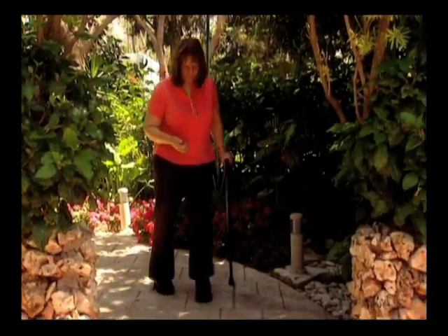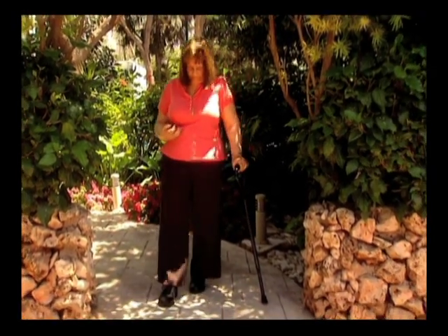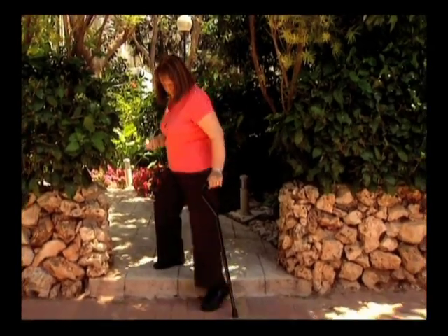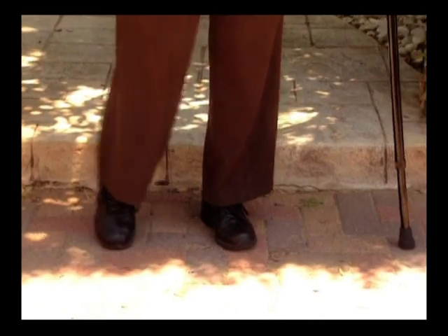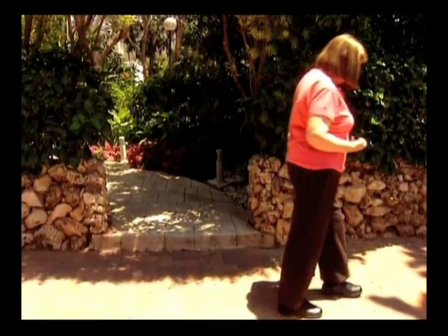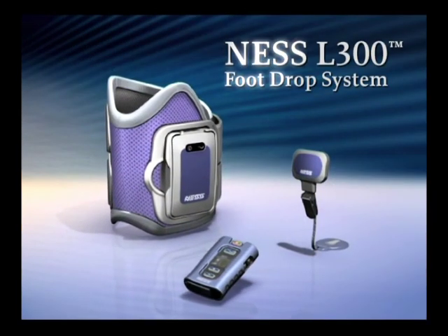Foot drop, a devastating result of stroke and central nervous system injuries, causes instability, diminished walking speed, and increases the risk of falling. Now the treatment of foot drop is stepping into a new era with the innovative Ness L300 foot drop system.